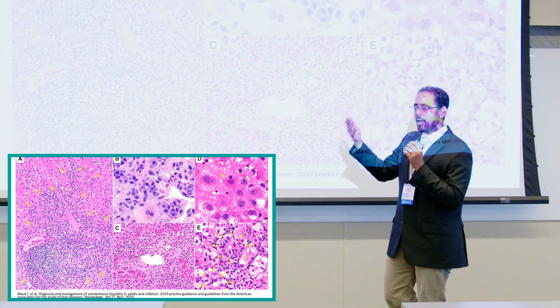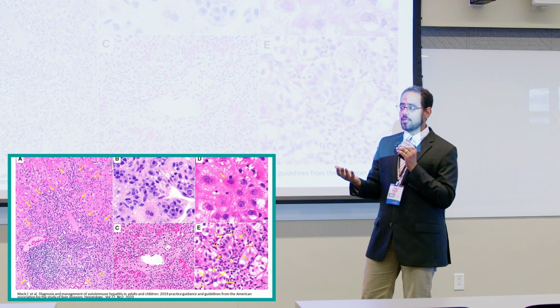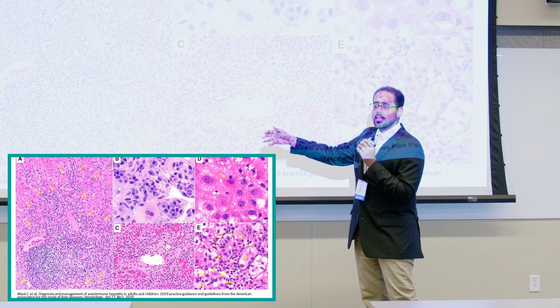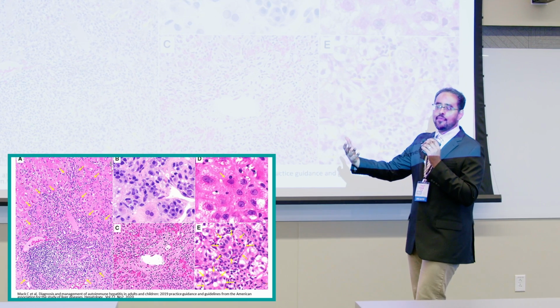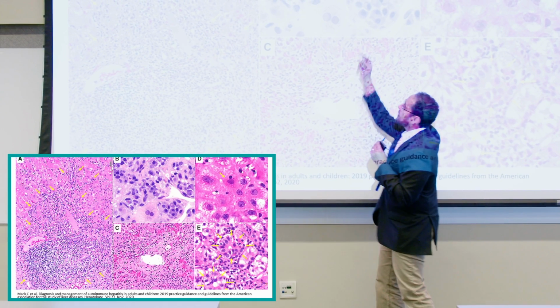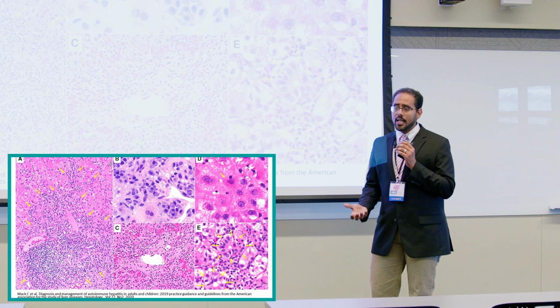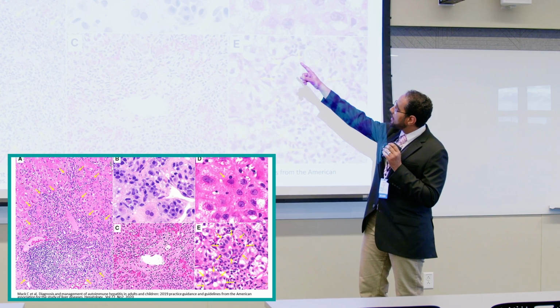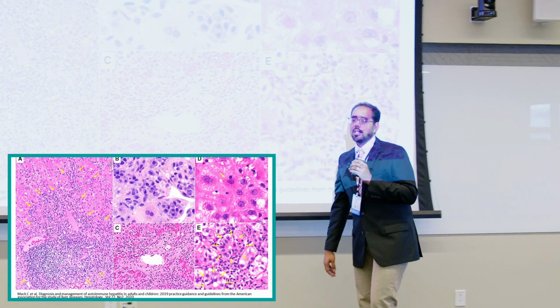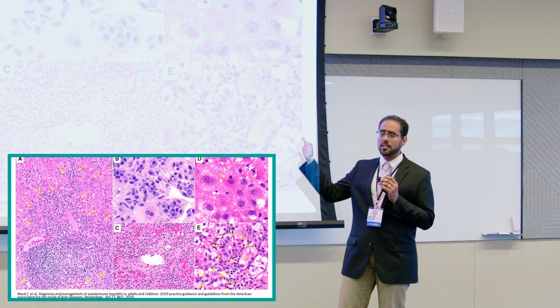One of the important things, I think someone probably discussed with you or you already know, is that T cells, part of the lymphocytes, are the ones that attack the liver cells. A lot of these small dot-like things are T cells, but there are some B cells too. When B cells get activated, they become what we call plasma cells. So this is one of the classic histologic features we see in the liver: a ton of inflammatory cells, some of them lymphocytes, some of them plasma cells. The plasma cells have this kind of belly in their cytoplasm, and this has a lot of immunoglobulins, which is why when they take a blood draw, they see a high level of immunoglobulin. And all these autoantibodies come from these cells.